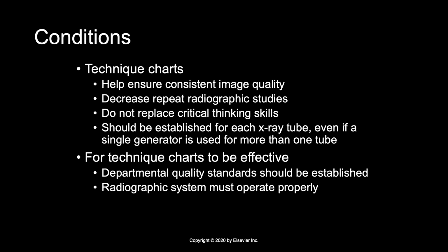Technique charts help ensure that consistent image quality is achieved throughout the entire radiology department. They also decrease the number of repeat radiographic studies needed, and therefore this will decrease the patient's exposure to radiation. But you need to remember that technique charts do not replace the critical thinking skills required by us as the radiographer.